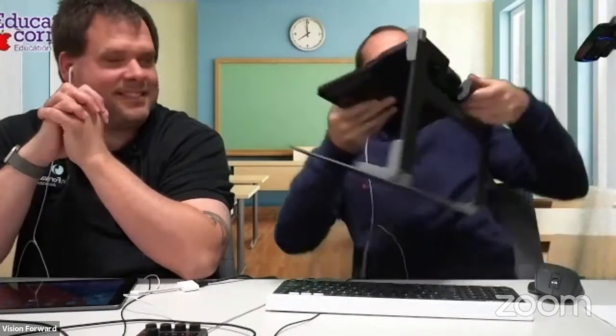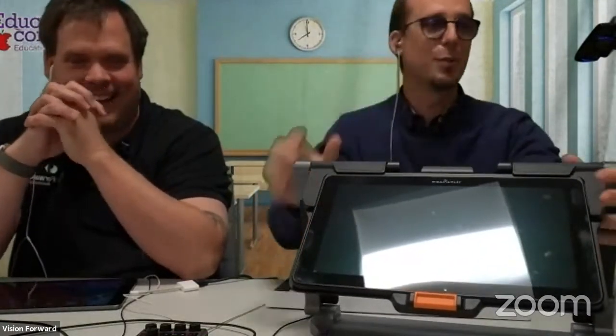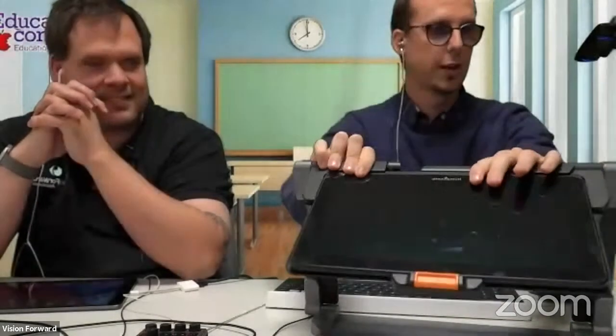Okay, here we go now. We're doing the best we can here because we have to show various size devices and various configurations, and we have one size table. We have one size table, and there's already many things on it. But here is the next device we're going to look at. Did you switch over to the main camera? So we're on the main camera at the moment, good.